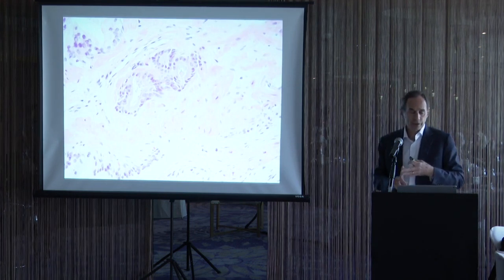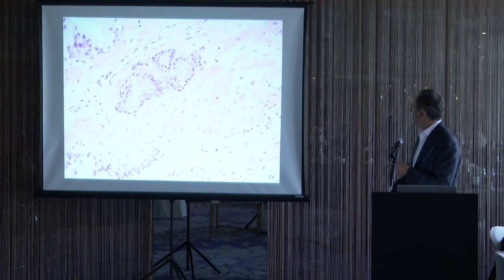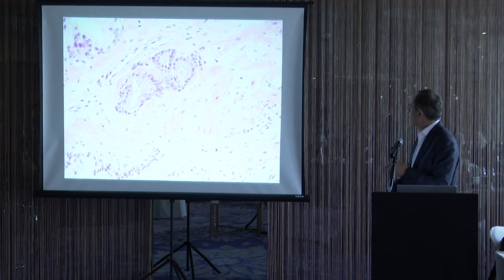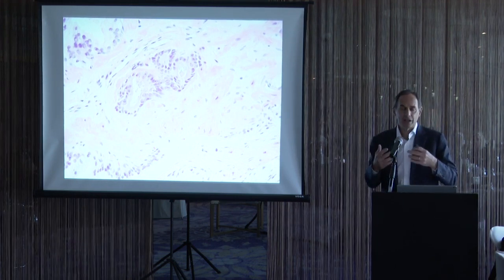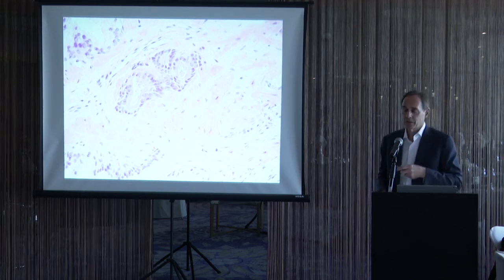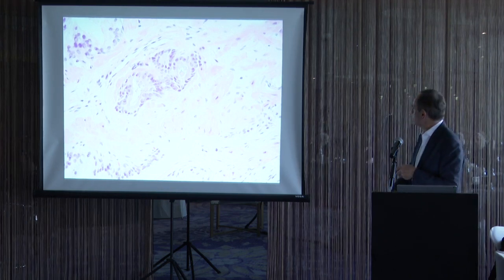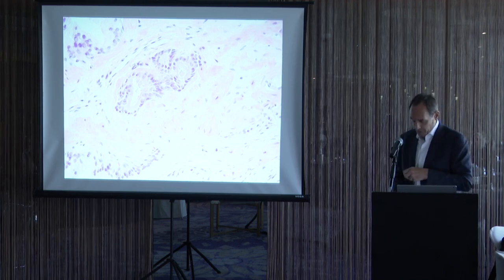Cytoplasm is very important, and in order for cytoplasm to be a good diagnostic criterion, you want to make sure that your benign glands have a very pale to lightly eosinophilic cytoplasm. Some of the consults I get, all the benign glands are dark cytoplasm, and you've lost that important potential diagnostic criterion. Here you can see small glands of cancer with very amphophilic cytoplasm relative to the benign glands.